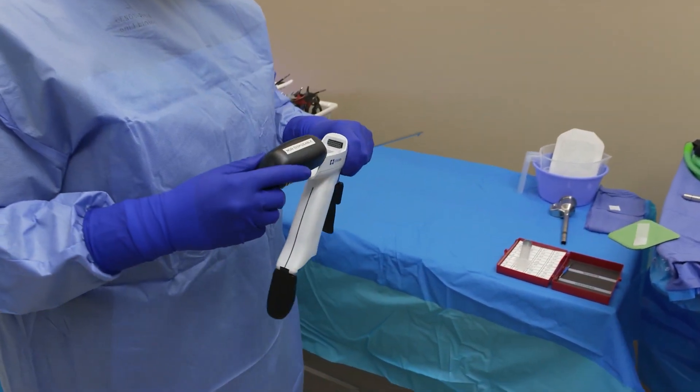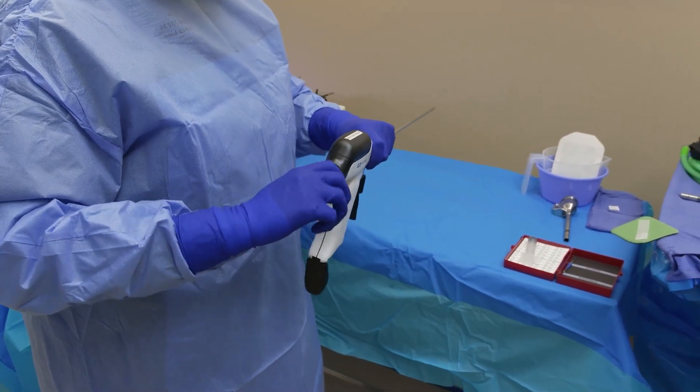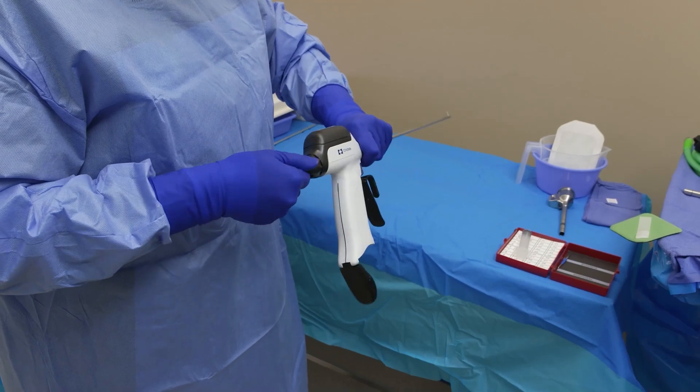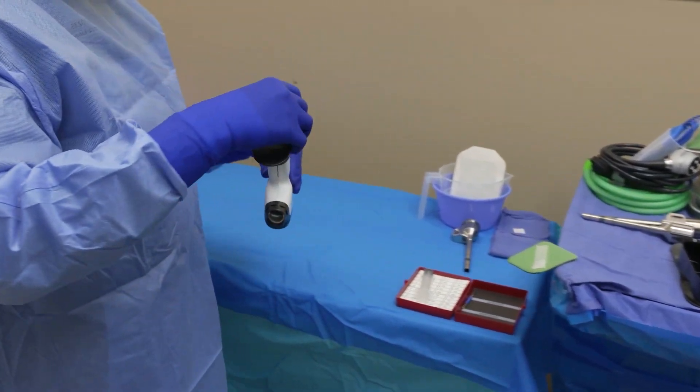What I hated about it was the cords. The staff hated putting it together, and then you have to plug it into the machine. Once we got something that was cordless, that's kind of a big change in how we operate.